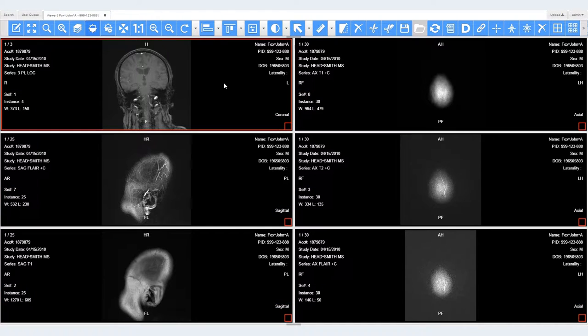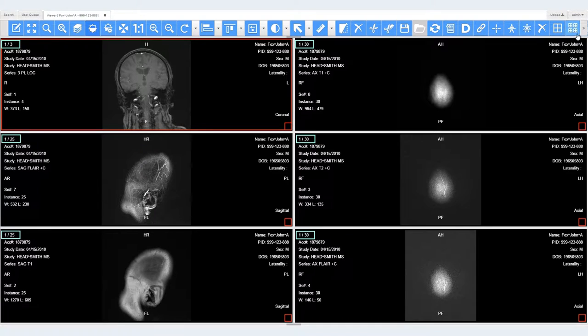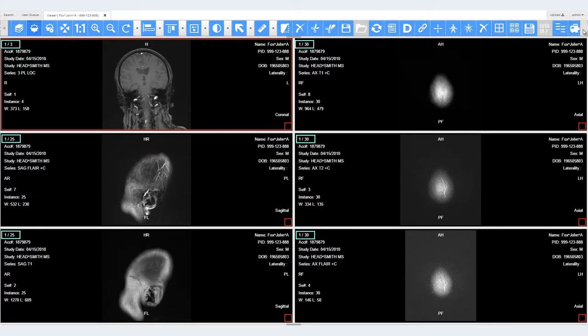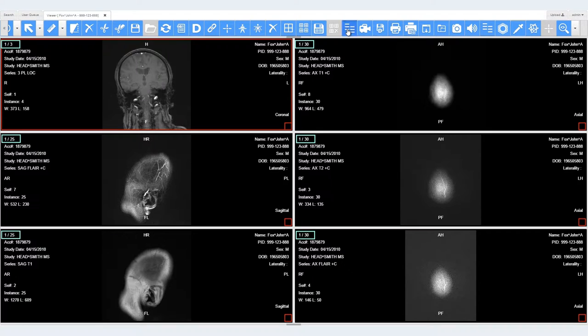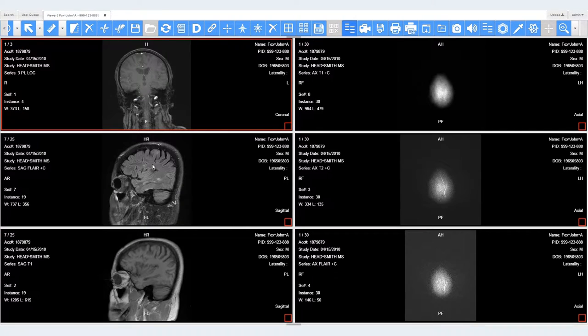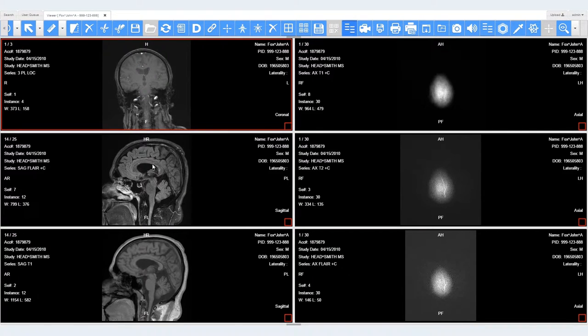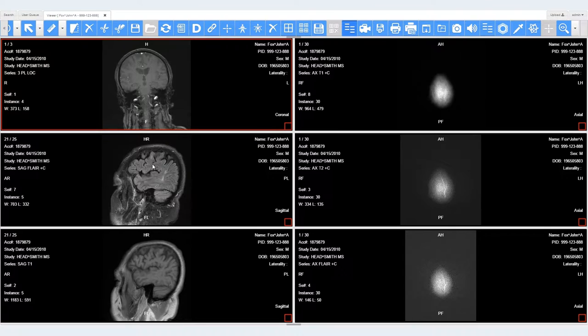During this video, keep a close eye on the slice number indicator in the top left of each cell. With series synchronization enabled, scrolling one series will scroll the other frames on the same plane.